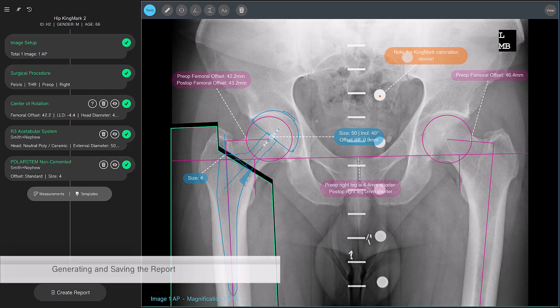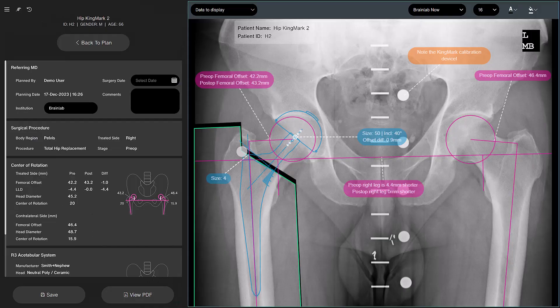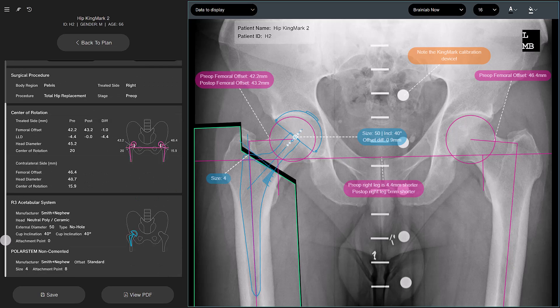So once you're happy with your plan, you can move on to creating a surgical report by selecting Create Report. TraumaCAD NEO presents you with an interface that has all the information compressed into one view. On the left side of the screen, you have a summary of the tools and implants that you added, presented in a concise manner.